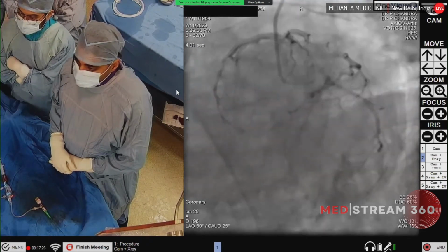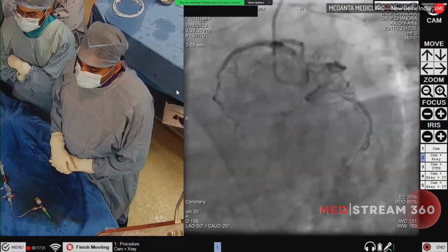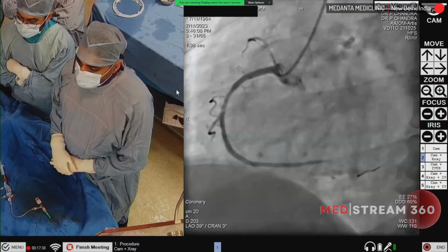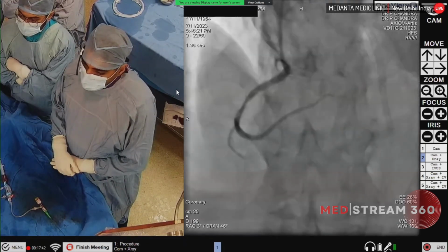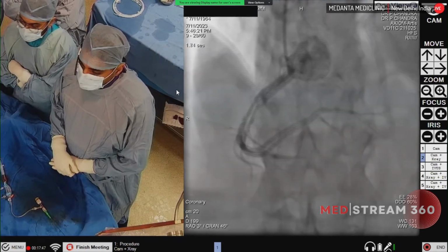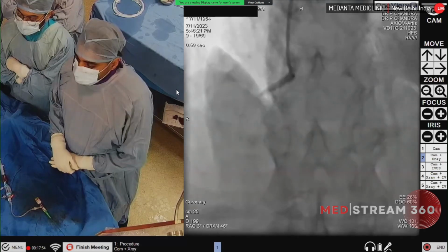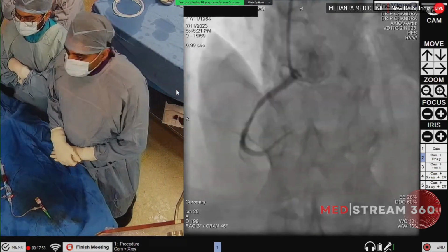Circ is a very small vessel and has an 80% stenosis in the mid part. And the main lesion was in RCA. Next please. So this was the RCA lesion. In between, at the midpoint, there is a ruptured plaque with a thrombus inside, and the distal PD also has some thrombus. PLV also has mid approximately 70 to 80% disease.